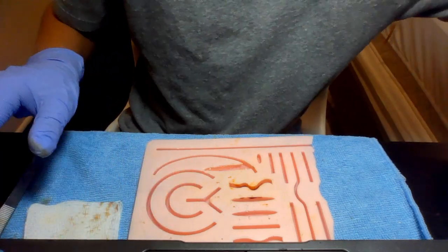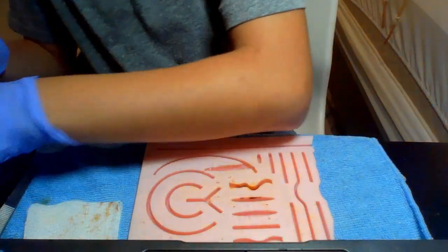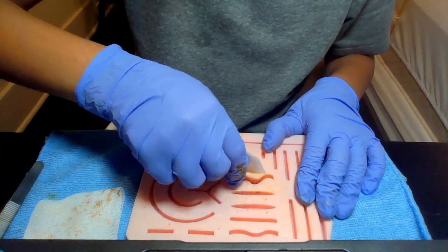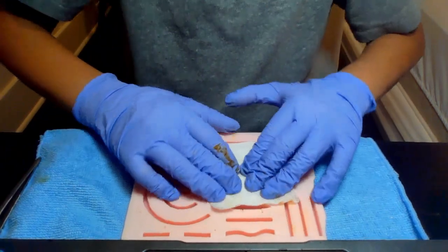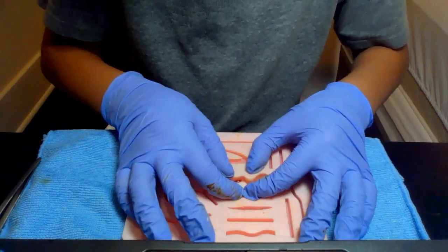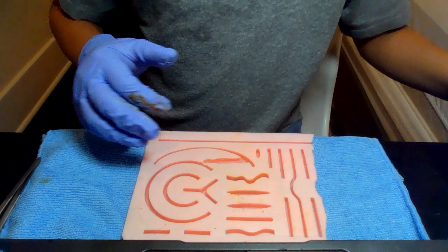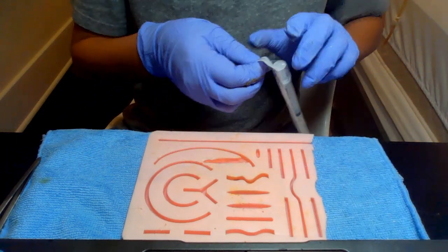We've got our gauze ready. Now, you could also use an alcohol prep pad, which I like to do, both just to be sure that we're having a nice sterile area. I like to use the alcohol on the top layer, and the iodine on the inside layer. Next, this will be how we're going to locally anesthetize.